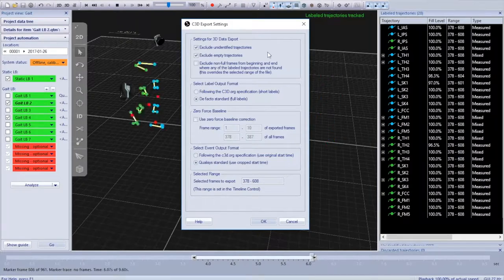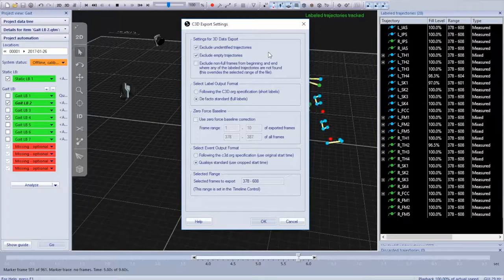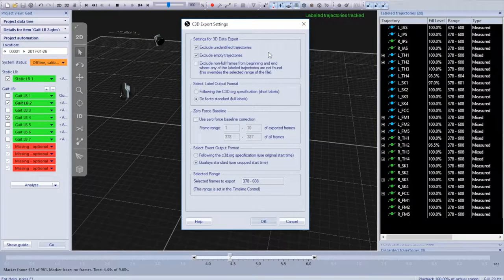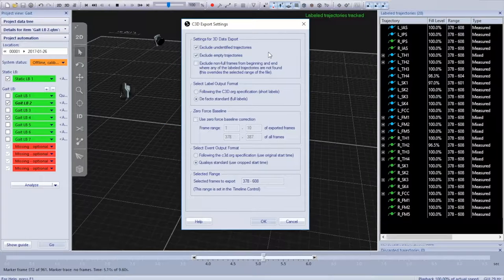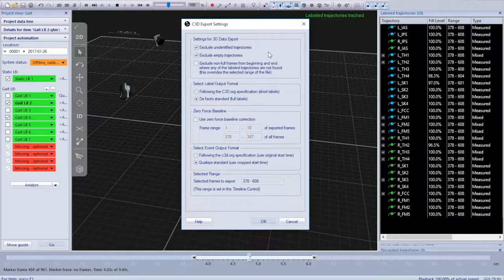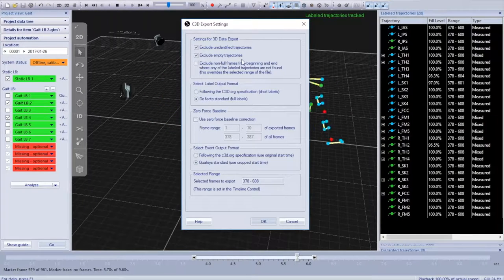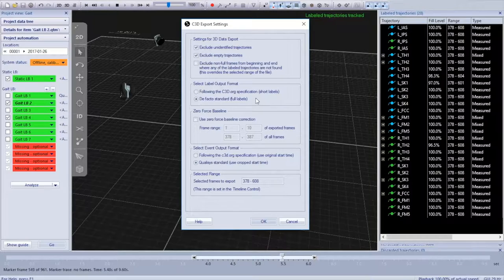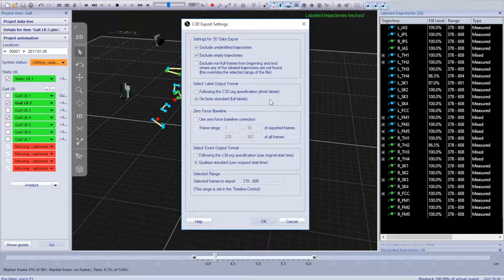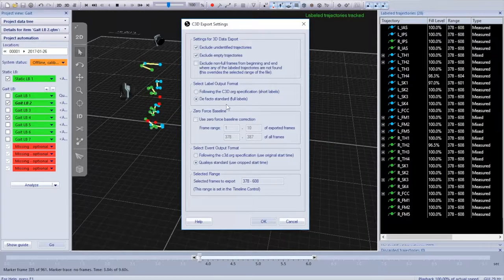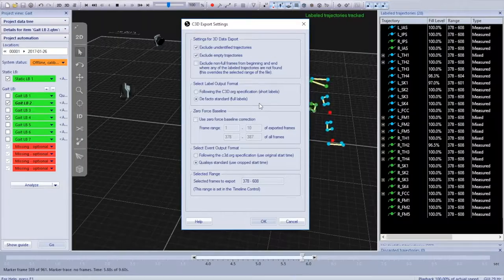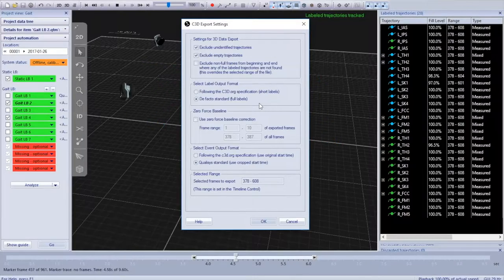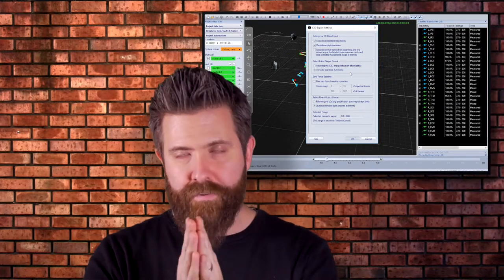Now notice I am excluding unidentified trajectories because I know that those trajectories are not what we are interested in. We're going to exclude empty trajectories and we're going to use de facto standard full labels.